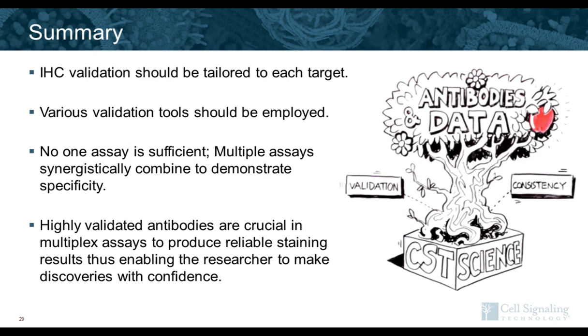And Chris, can you comment on using polyclonal primary antibodies, rabbit, et cetera? Yes, of course. There's no reason you wouldn't be able to use rabbit or mouse polyclonal antibodies with the OPAL kits. However, generally speaking, using monoclonal antibodies, whether it's rabbit or mouse, leads to more consistent signal and consistent performance from lot to lot.